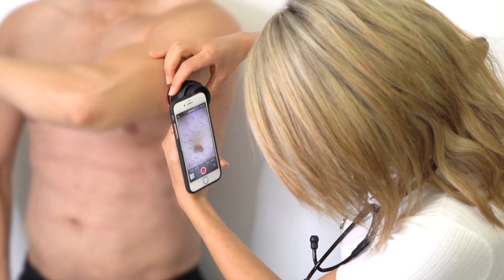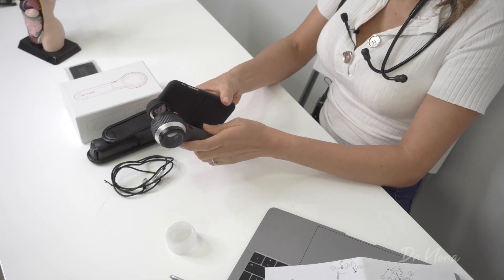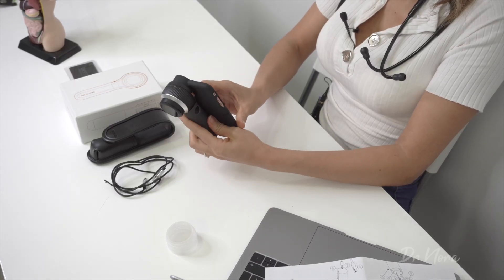So there you have it — the Dermlite DL4. It's light, it's easy to use, it gives polarised and non-polarised light, and even allows for 10x magnification. And what's cooler than that is this smartphone case for the Dermlite DL4, which allows me to look with my smartphone and take pictures for educational purposes or even just to put them onto the patient's files. It's a magnet so it goes on like this, and I can easily sync this up to my phone and take pictures of any lesions I'm concerned about, then import them into the patient's files directly.